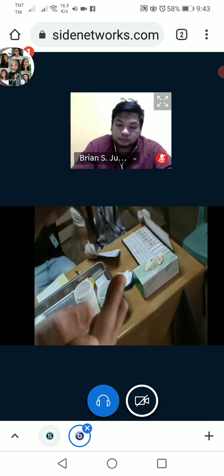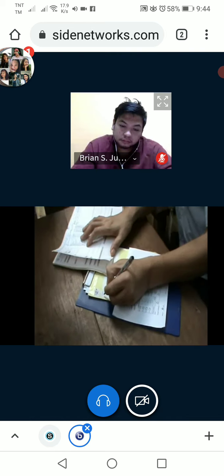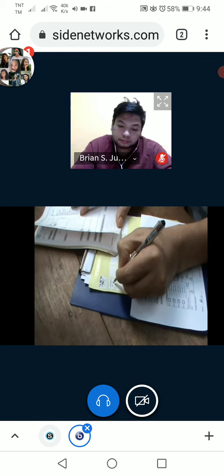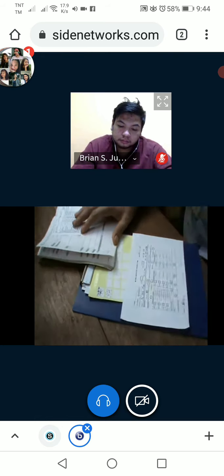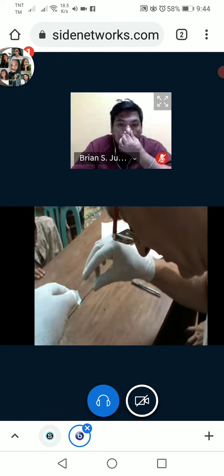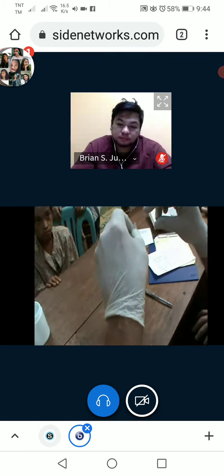The patient should be seated comfortably. Then record on a request form and a slide. Here it is done with a sticker, but it can be done on the thin smear with a pencil. Record should have at least a code or a name and the date. Check the slide is clean, free of dust or fingerprints. If not, clean it with a dry piece of gauze.